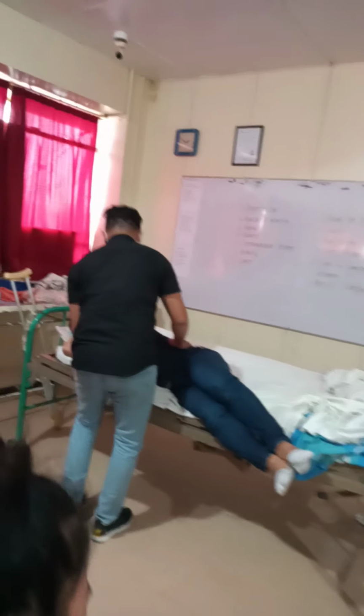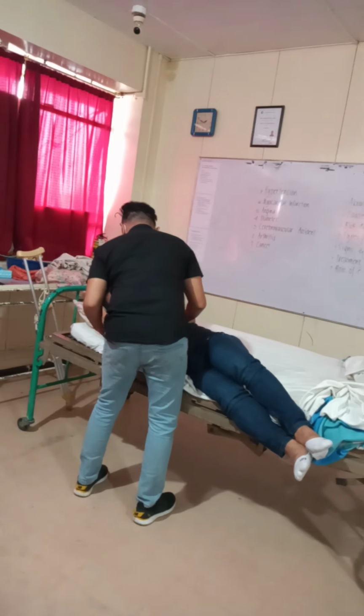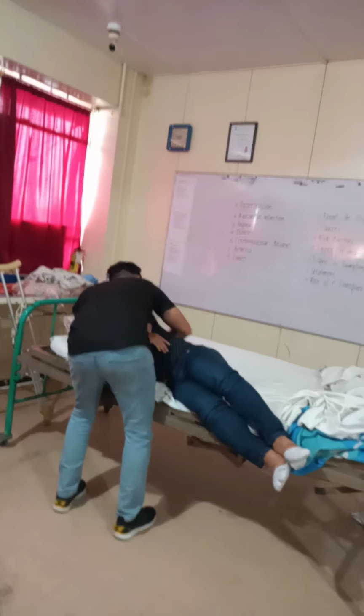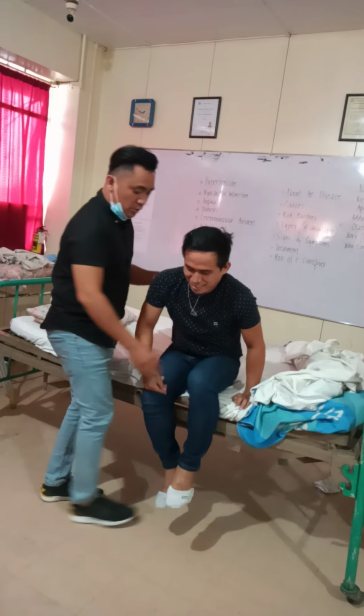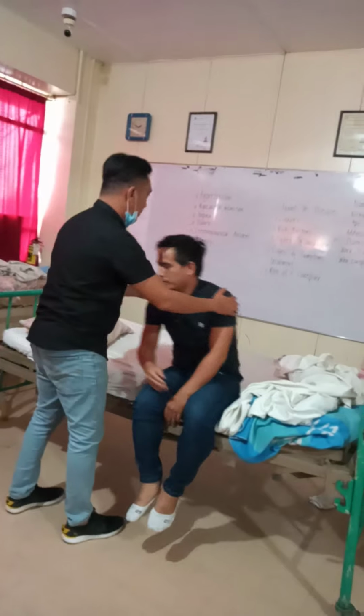Okay? So sir, palingkod ka sir ha? Sir, at the count of 3, palingkurong tika ha? Okay. 1, 2, 3. So kung nakadrop ang tiil daan ni patient, okay ra kayo. Now, kita balik.